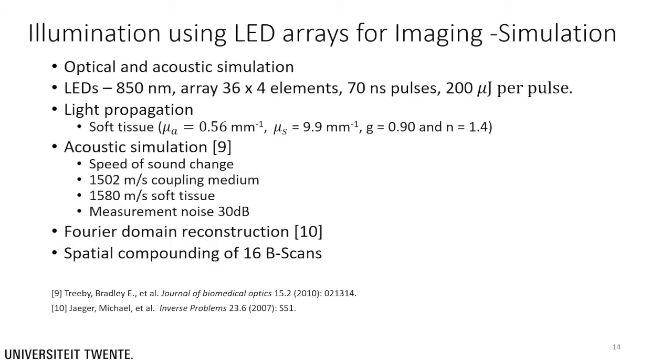To test these configurations of the LED arrays, we performed a numerical study, and we did both optical and acoustic simulations. The light propagation was simulated using Monte Carlo, using the LED specifications and a phantom mimicking soft tissue. And here you can read all the specs. The acoustic forward simulation was performed using the K-Wave toolbox, and reconstruction was done with a Fourier domain reconstruction algorithm.